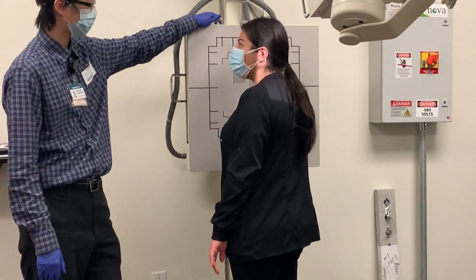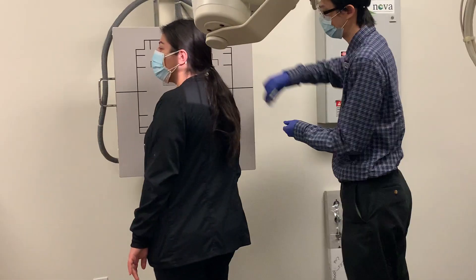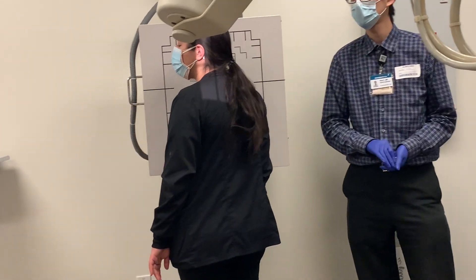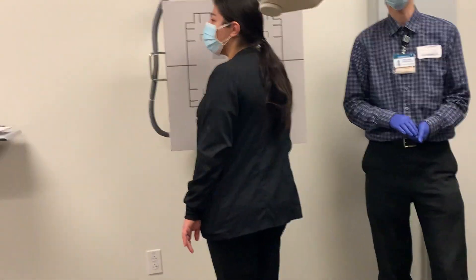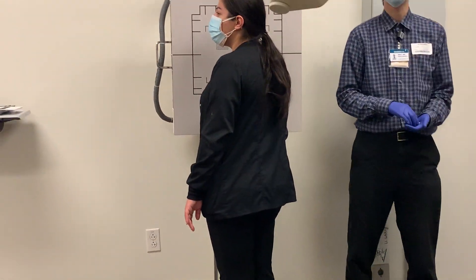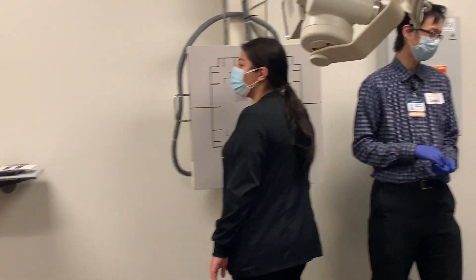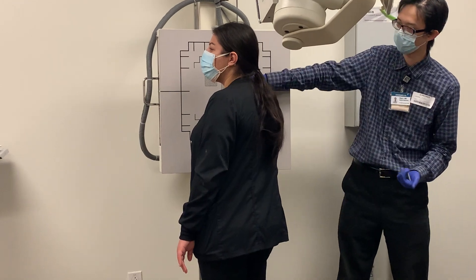This time, because the right side is closest to the detector, I'm going to go ahead and mark the right side over here. What kind of breathing technique do we use for the obliques? Hold your breath.